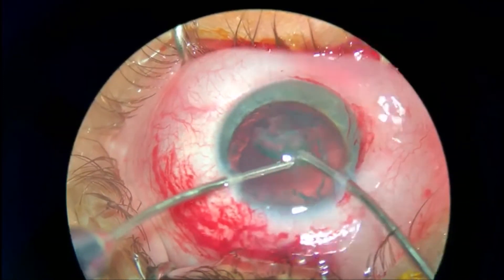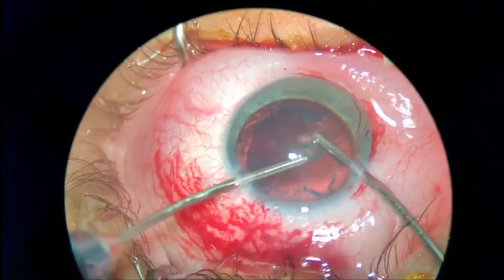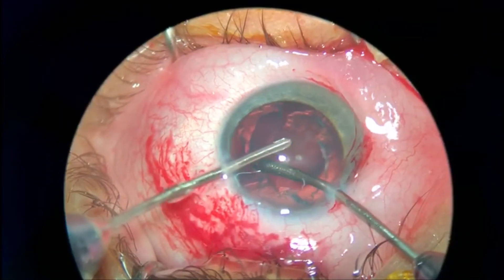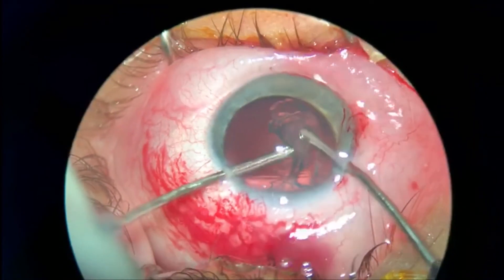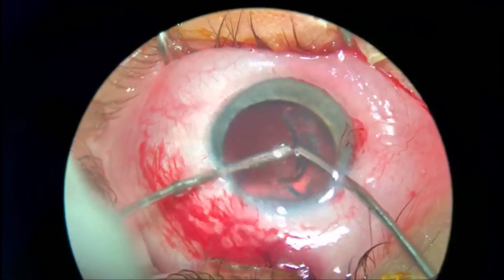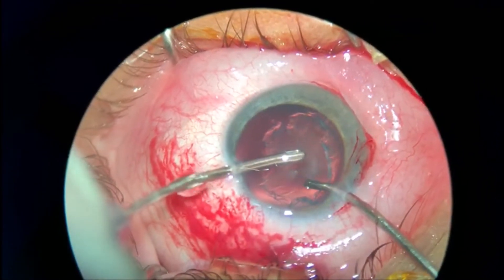You can use both instruments just like chopping — like you do chopping with a chopper, you can use the instruments and press them against each other.